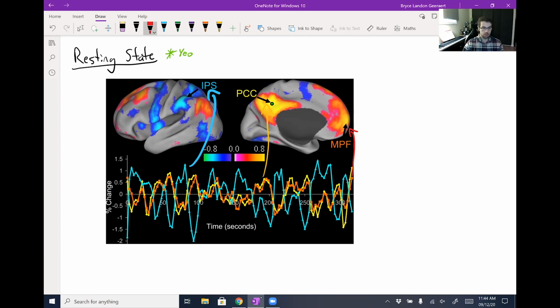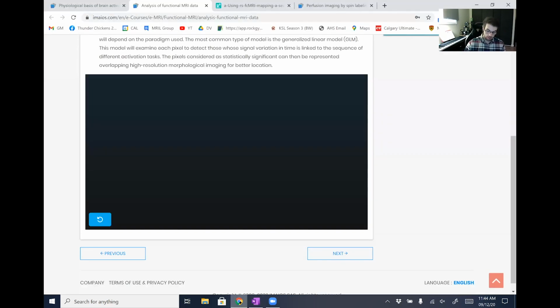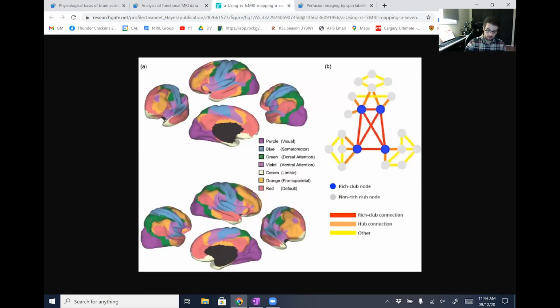And you can get some really, really cool stuff out of these studies, which are all the rage at fMRI conferences. Here's just one example of a nice atlas from 2011 that identified 7 different principal components in their analysis, and said, okay, these sets of regions belong to 7 different networks, and based on the roles of those regions from previous research, they came up with an explanation.